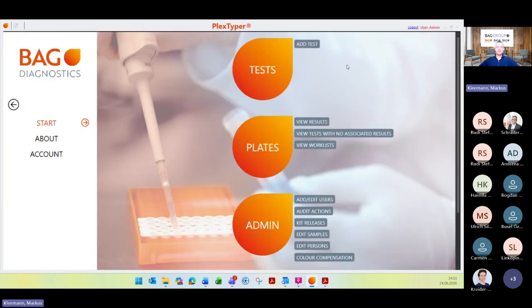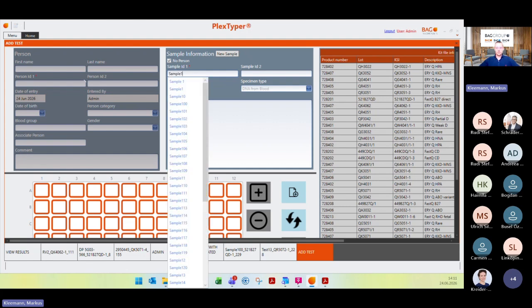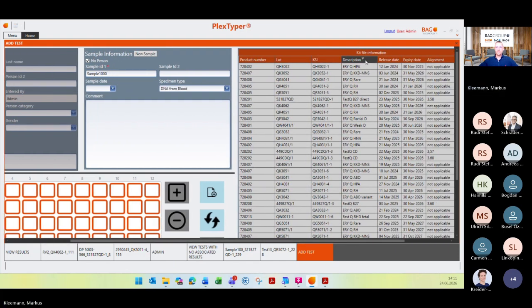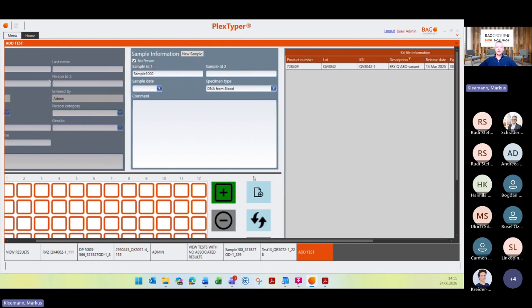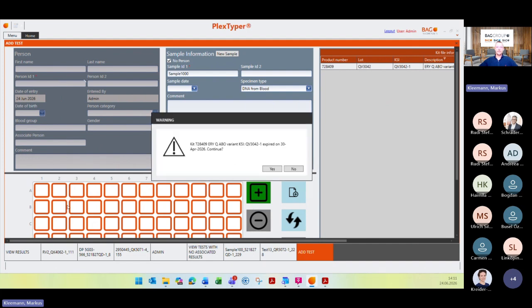With this, I jump over to this tests area here and want to create a new test. So you know that the sample ID is needed for PlexTyper, which is then connected to any of my kit files. I create a sample 1000, for example, and connect this to, for example, REQ ABO variant. Then you see that this button here switches to this green color, and then I can place this sample on my plate. But here you can see this warning occurs.